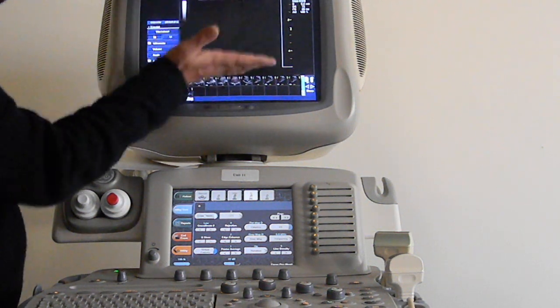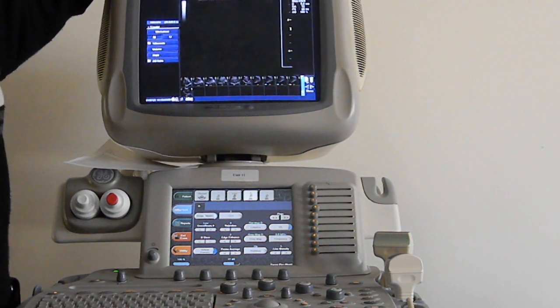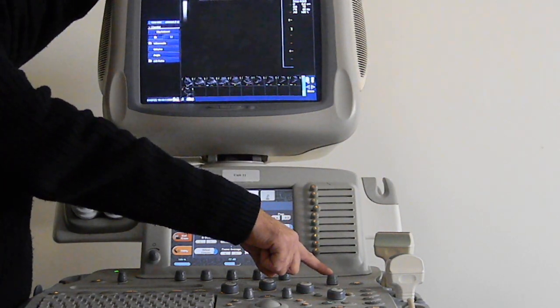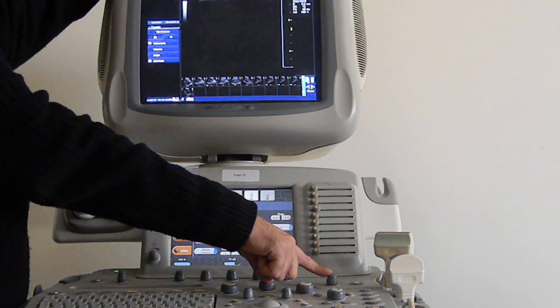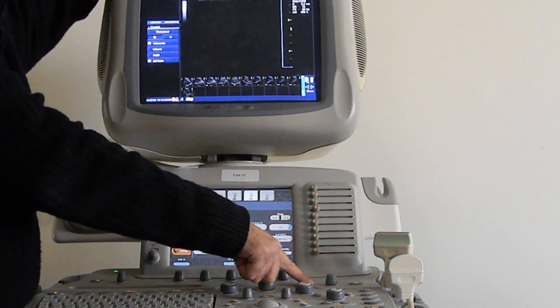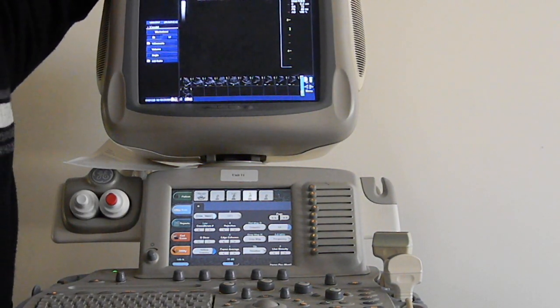And you cannot squeeze the graph together like this, so there has to be a button. This knob here is the button for depth. The manufacturer is so gentle that he even mentioned that. And what's the common concept?